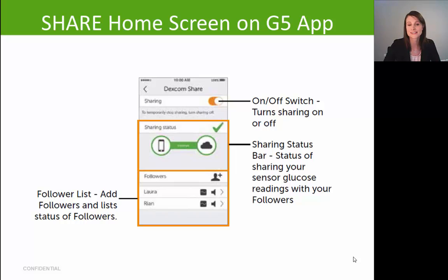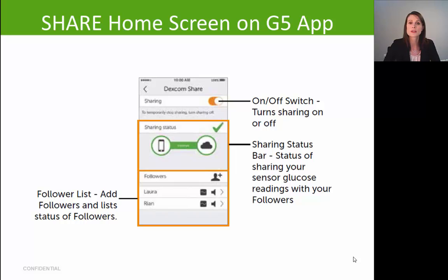In the middle of the share home screen you have your sharing status, which indicates if sharing is working properly and if your follower is receiving your glucose information. If it's mostly green with a green check mark, your follower is receiving your data and share is working properly. If any component is red or you see a red X, share is not working properly. It's also important to understand that for share to work, both the sharer and the follower need an active internet connection — either Wi-Fi or a cellular data plan.